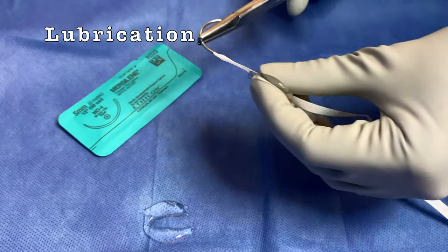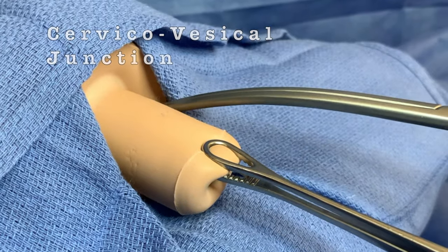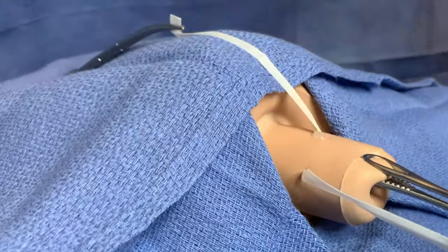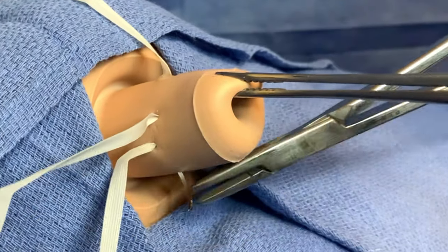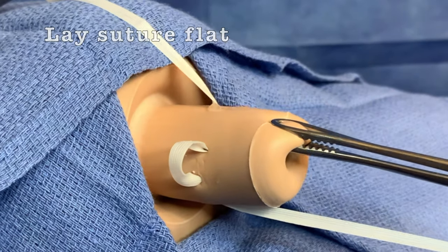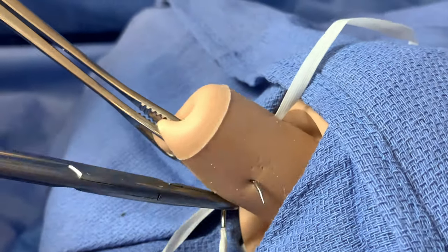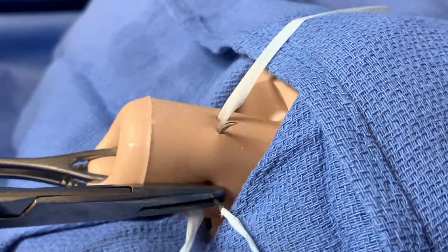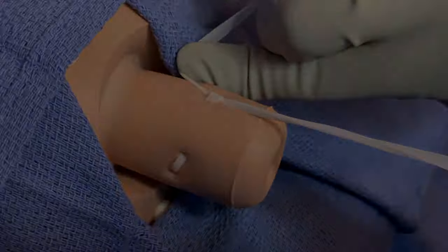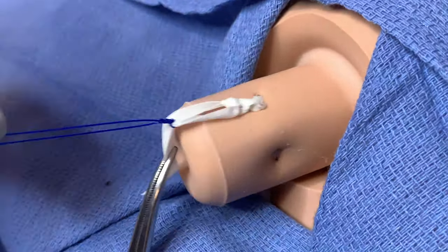Mersilene must be well lubricated prior to suture placement on the cervix. This decreases friction and tears on the cervix from the wide suture. Mersilene needs to be laid flat, as demonstrated with the use of a pickup. This positions the suture as wide as possible and increases its durability. Lastly, it is hard to make an air knot with Mersilene; we recommend tagging it with a prolene knot to assist with removal later in the pregnancy.